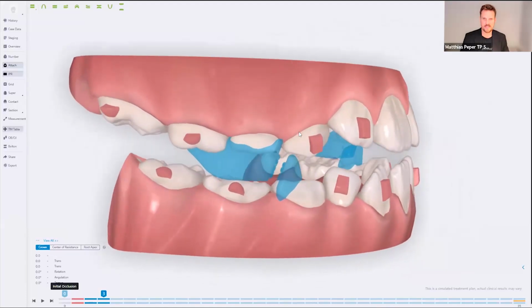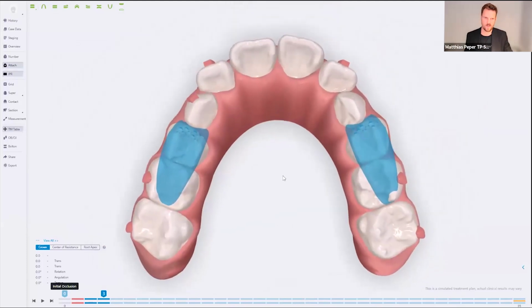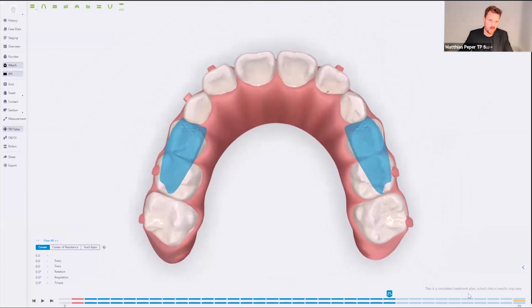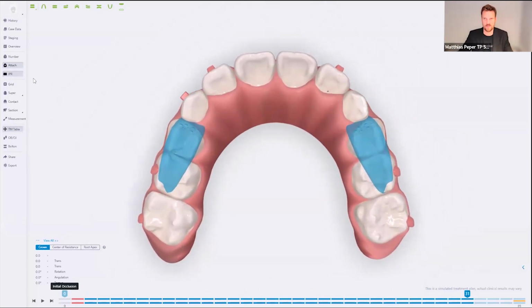And the interesting thing, or the difference, is that Angel Aligner says you don't necessarily need a pre-MA phase. So you can see that we can do the expansion the whole time while we use the occlusal mandibular advancement. We can use it from the beginning till the end. And you don't necessarily need a pre-MA phase.